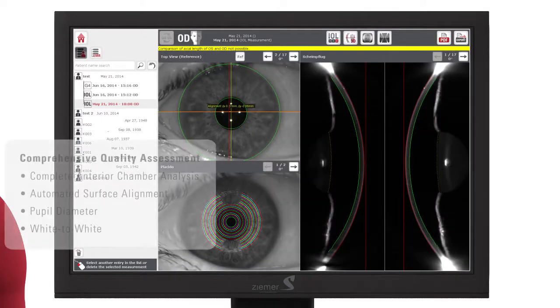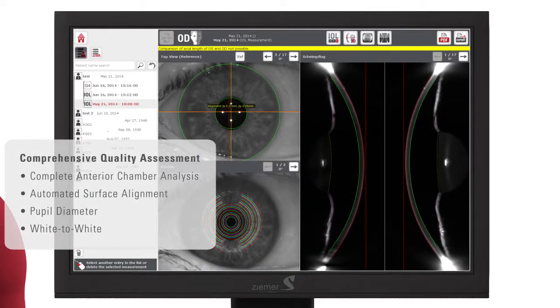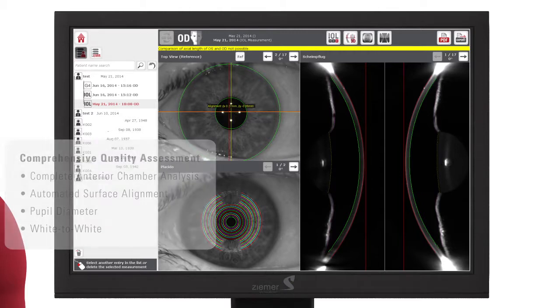A comprehensive quality screen allows for a thorough analysis of the quality of your Scheimflug and Placido images, as well as the alignment of the exam and the detection of white-to-white and pupil diameter.